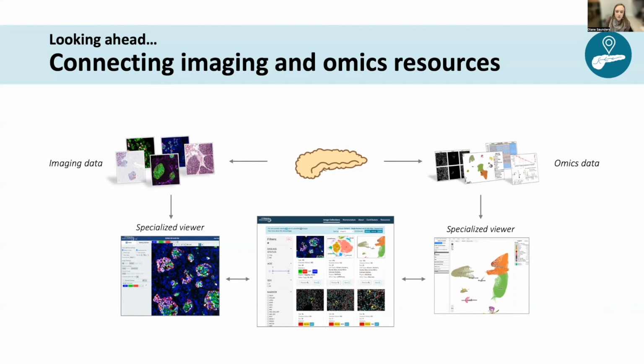And so clicking on those cards would launch into a different viewer rather than launching Path Viewer. But the value here is really having this one platform that houses all of the data in the same kind of format and annotations so that people can easily view and access data sets that they need from one place.